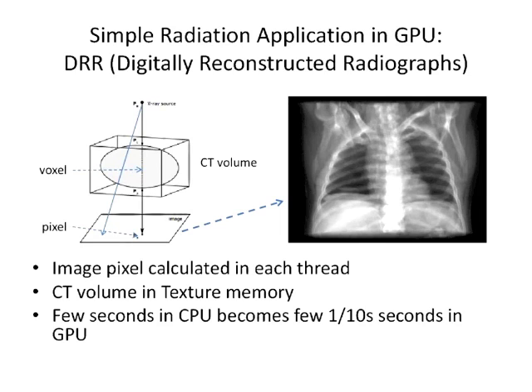It was just the one passing through directly. Later you can see the scattering. All those things are considered in either hybrid DRR to Monte Carlo or Monte Carlo. But here, it was just a pure one ray without any scattering. I see. Okay, thank you.